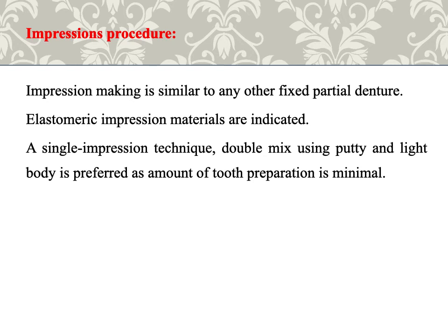Impression procedure. Impression making is similar to any other fixed partial denture. Elastomeric impression materials are indicated, and a single impression technique, double mix using putty and light body, is preferred as the amount of tooth preparation is minimal.